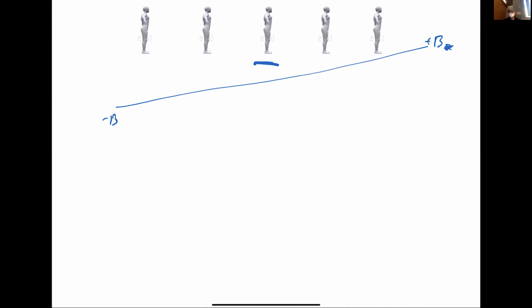So this person here is going to go clockwise, by say 90 degrees each step. This person here is going to go 180 degrees each step. Just like what we saw in those movies, it's going to go more clockwise, right? This person here is going to go 90 degrees counterclockwise, and this one 180 degrees counterclockwise. Because if you're in a stronger field, you're going to have more clockwise rotation than if you're in a weaker part, where you're going to have more counterclockwise rotation.